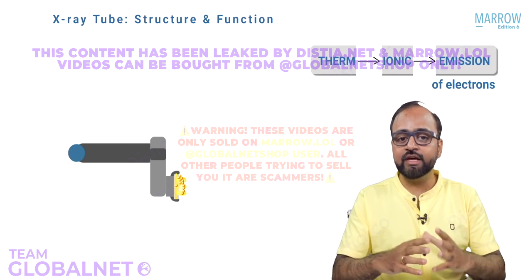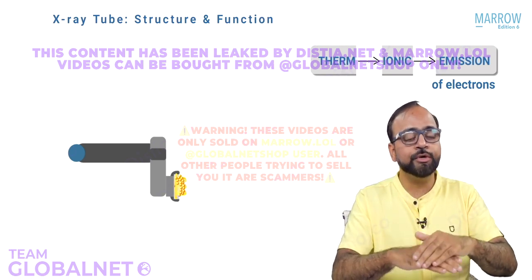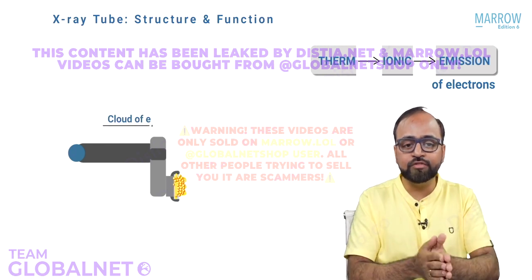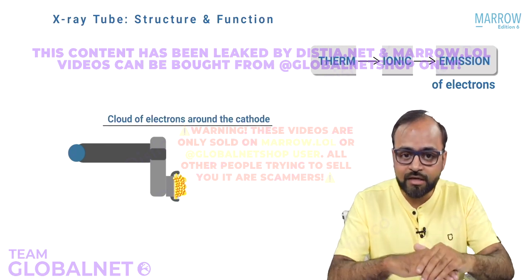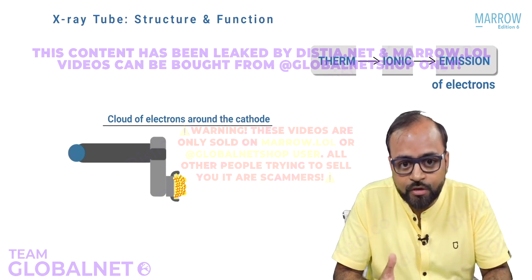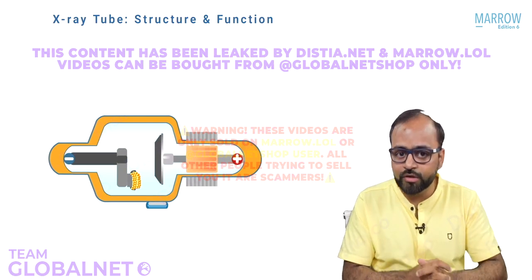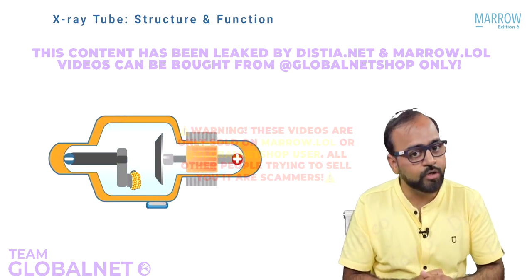These electrons, when they are emitted, remember inside the tube there is vacuum. So these electrons are going to accumulate around the cathode filament as a cloud of electrons which is going to form around it. So just see now, look at the X-ray tube. There is a cloud of electrons which is formed around the cathode filament. Now what is going to happen?